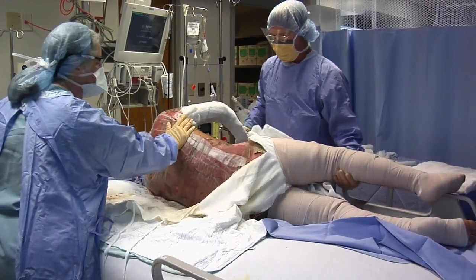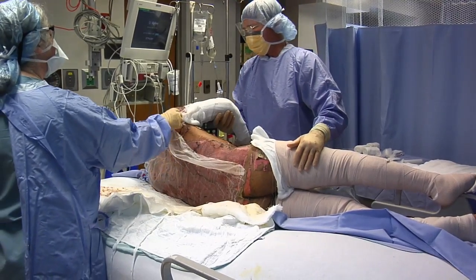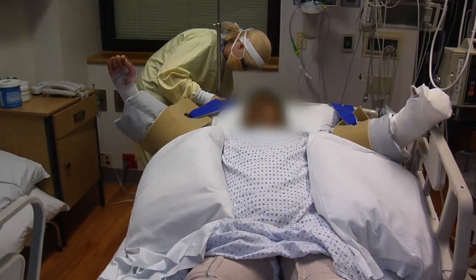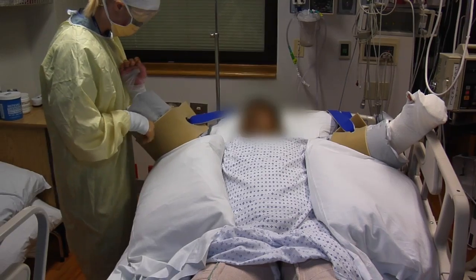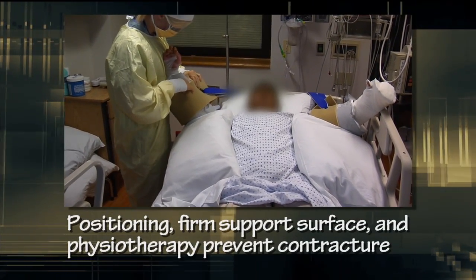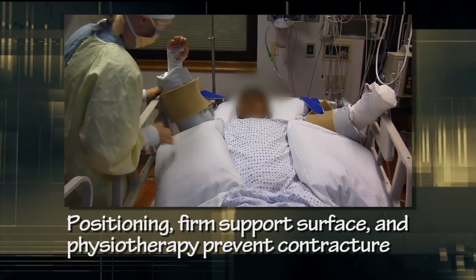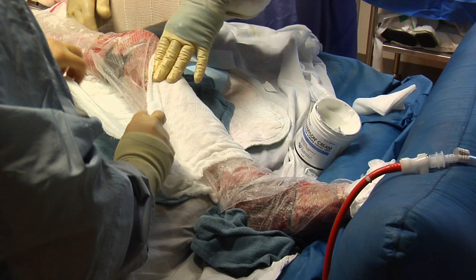The optimal position for a patient with burns crossing the hip is with the hip in extension. Patients with burns crossing the lower abdomen and upper thigh seek a position of comfort with hip flexion. This positioning can be reinforced by lower extremity elevation, trunk flexion, and by an insufficient support surface while supine. The hip is not amenable to splinting, thus careful positioning, firm support surface, and early physiotherapy are required to prevent hip flexion contracture. The protective position for the knee is full extension.